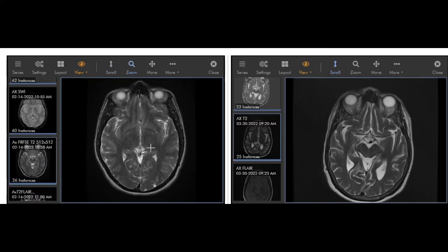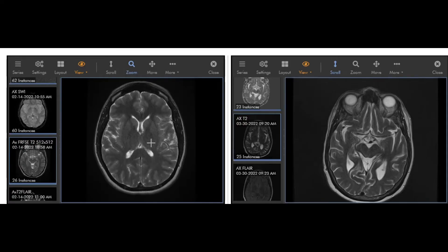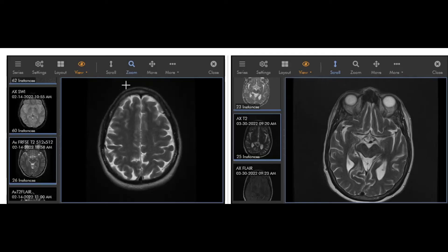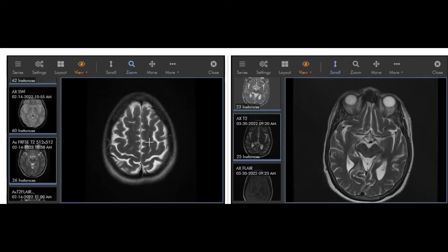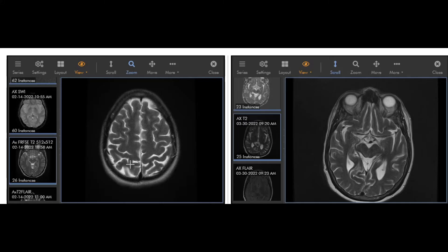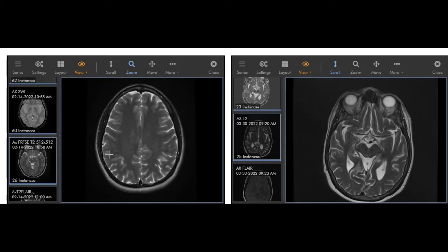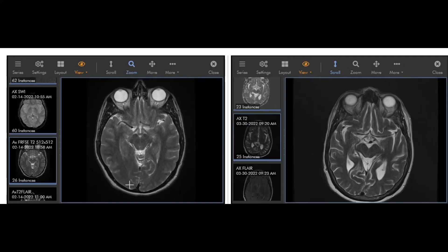Okay, so what I want to do is show a normal brain over here. So this is in an axial view, this is a cross-sectional view, where this is actually the face or the front, and this is the right side. So these are those frontal lobes here. So they go to about this area here on both sides. So the frontal lobes, these are parietal lobes back here, if you remember, and then the temporal lobes here and occipital lobes back here.